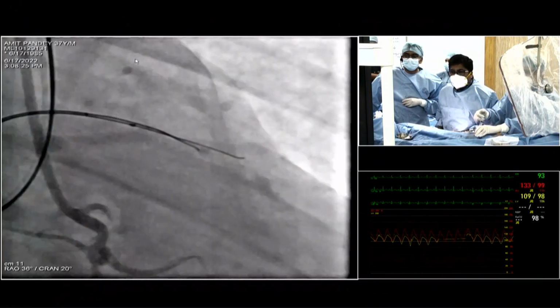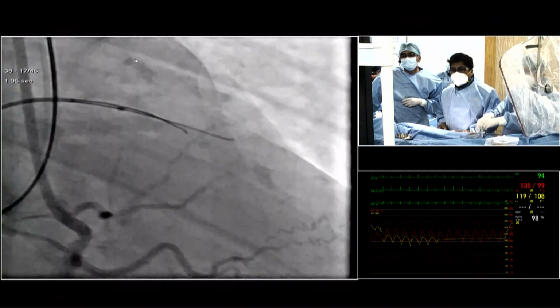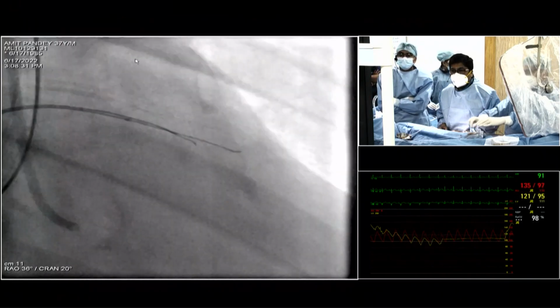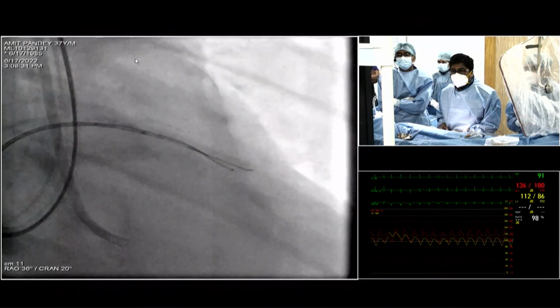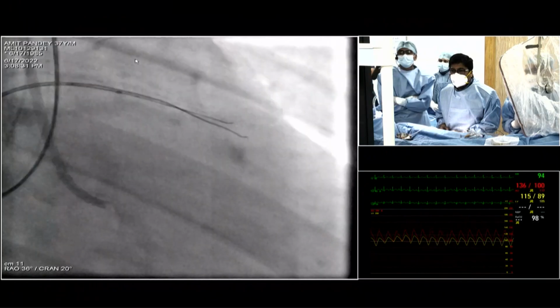Come on. Kissing, do you go 1:1 dilatation or a lesser size? Dr. Goel, we're back with you. Kissing 1:1 or lesser size? Kissing, if you want to do the LCX, you take a 1:1 balloon or you go lesser size? Which wire? Just ask the wire. Not much disease in the circumflex.